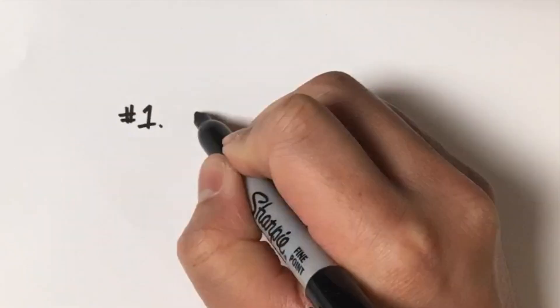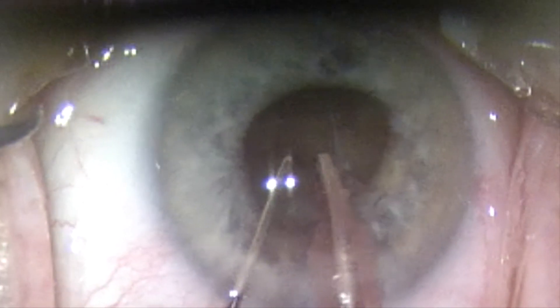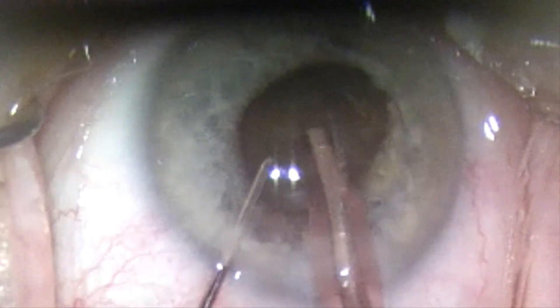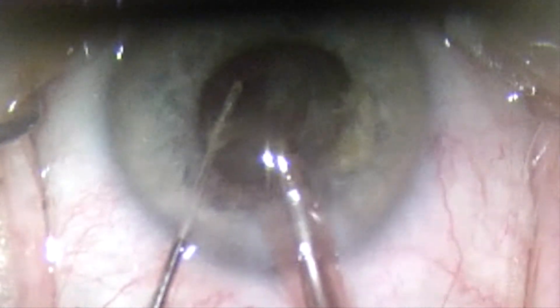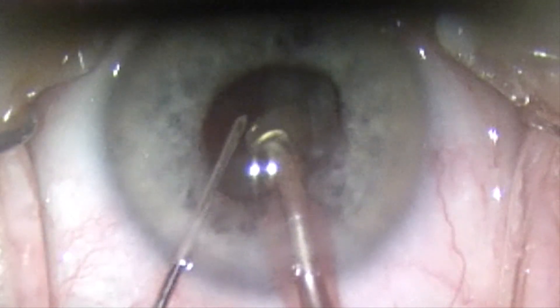Tip number one: Be precise. Minimize instrument exchanges. Each time an instrument is removed and placed again through the main incision, there is risk of iris damage. Pause for a moment — this allows the intraocular pressure to decrease enough for you to safely exit the eye without bringing the iris along with your tools.